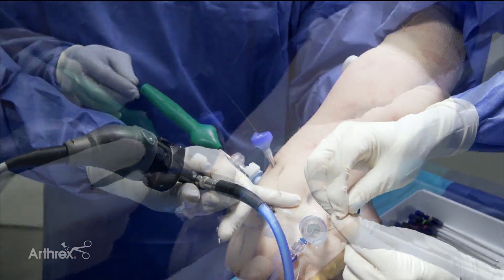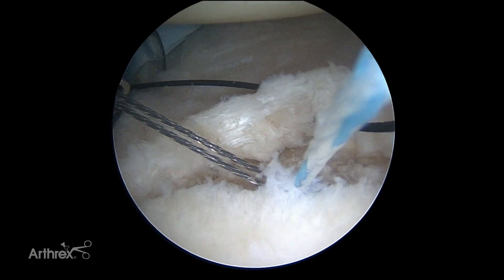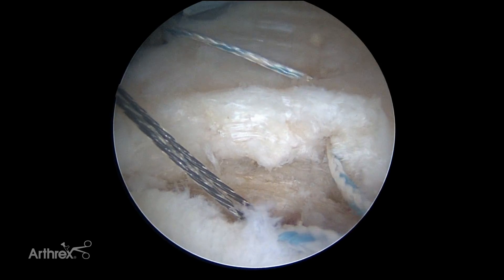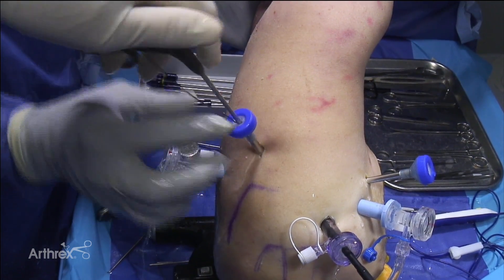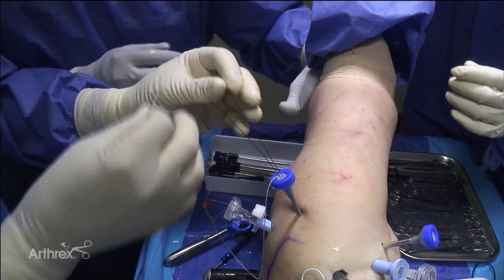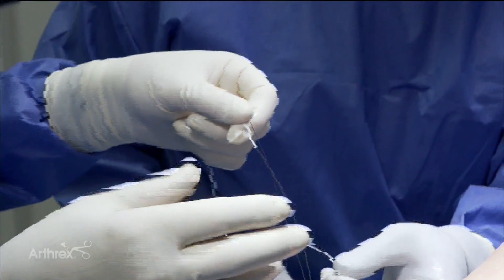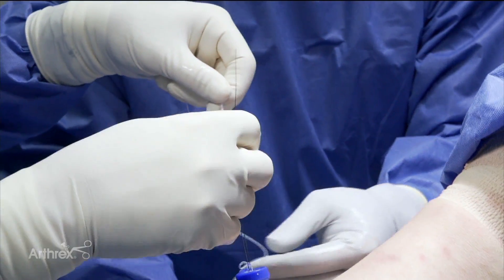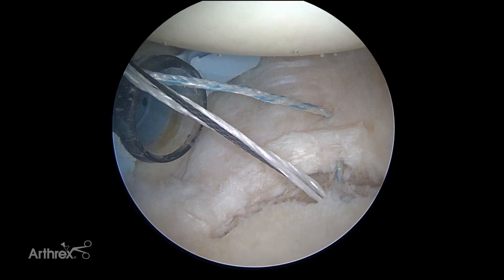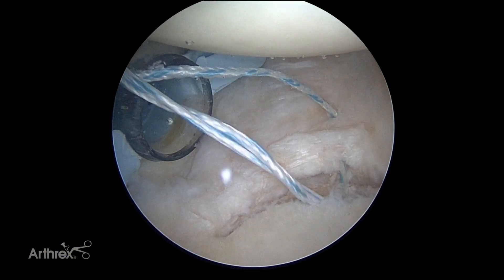On the outside view we're threading that suture through the nitinol and pulling it up and through the labrum, taking out the slack. We bring it back up through the working cannula where the nitinol wires are. There's a white part that's slightly thinner before the markings start on the suture — you want to double it over on itself in that white thin section, then pull it down until it reaches the anchor. Once there, use a series of short little tugs to thread it up and through, and then you can tighten it.